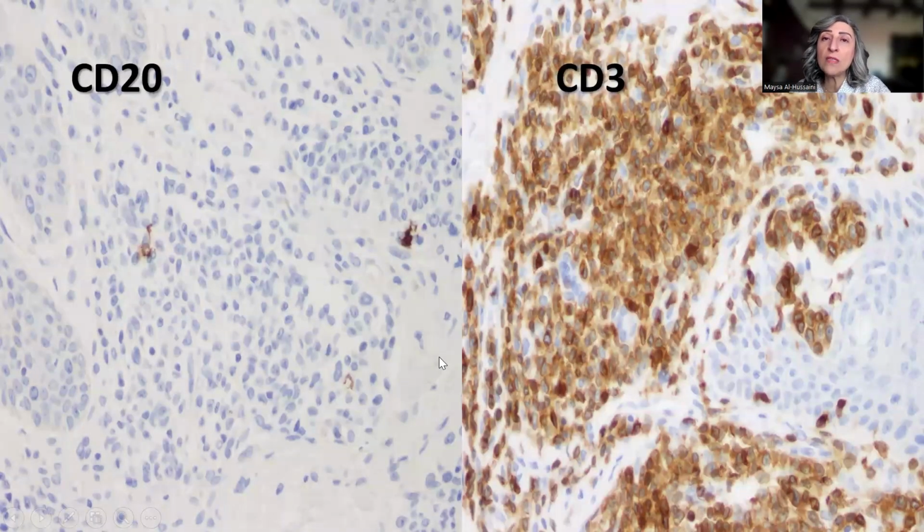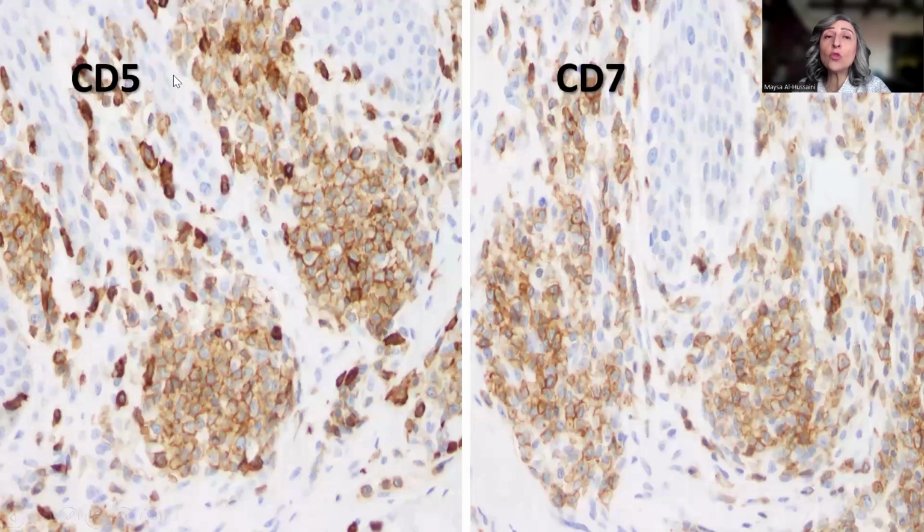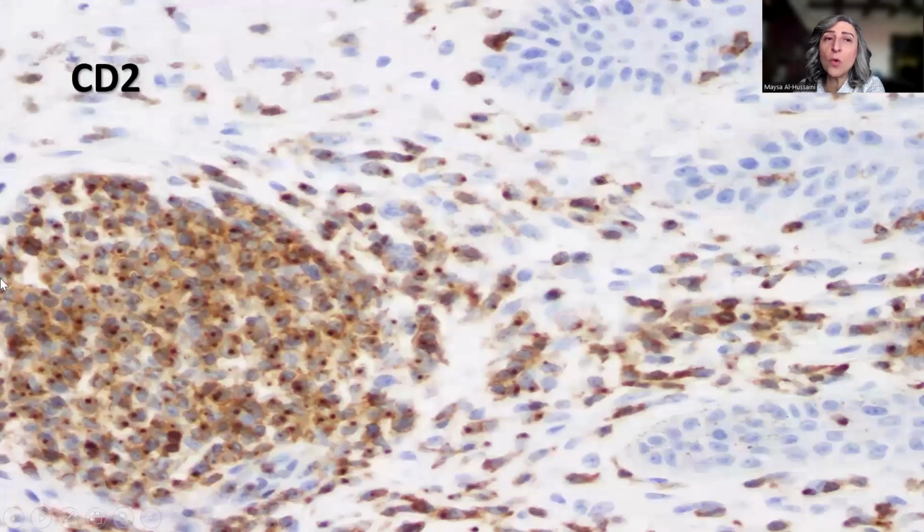Now, looking into the immunohistochemistry, first of all, we want to know what is the nature of the tumor cells. CD20 is almost completely negative, while the infiltrate is positive with CD3, and the infiltrate also shows positivity with CD5 and more or less CD7. So there is no loss of antigenicity with CD5 or CD7, as you would kind of expect, especially with mycosis fungoides. CD2 is also positive, beautifully showing the positivity with this perhaps unusual pattern of staining with the dot-like cytoplasmic staining, but in general, this is positive.